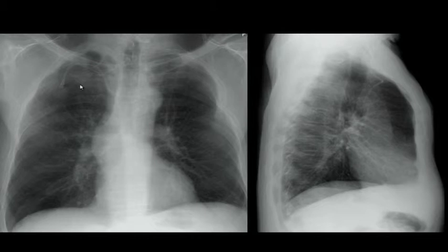Okay. Then what happened to it? It should have just gone down normally into the right brachiocephalic, then SVC, right atrium, right ventricle, IVC, right? So what is this crossing over? What's going on? Either they've got some sort of heterotaxia or it's in the aorta or in the arterial system. What is the one thing that's telling you that probably it's not in the aorta on the X-ray?